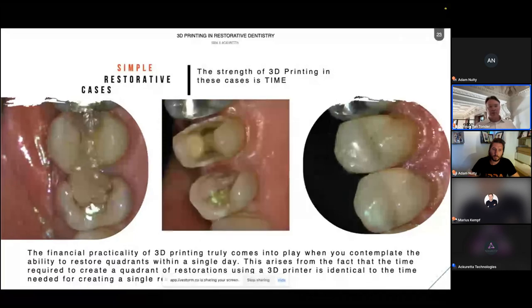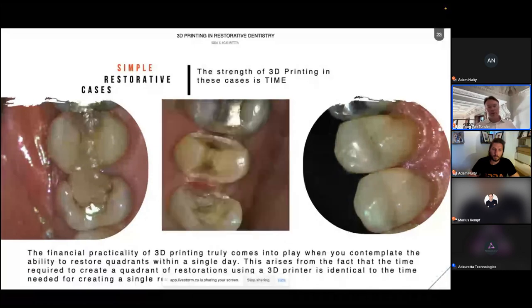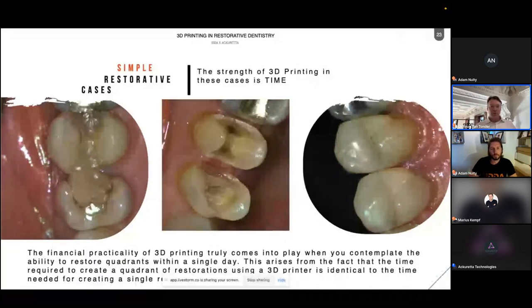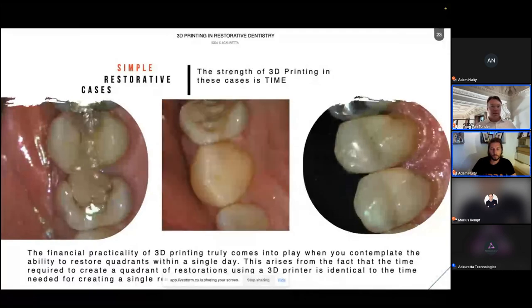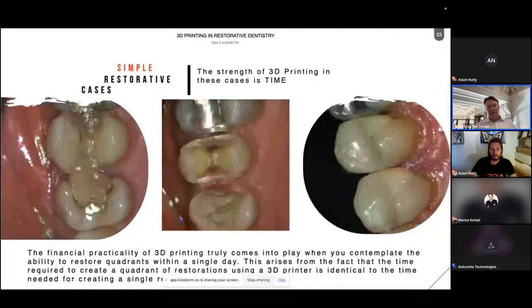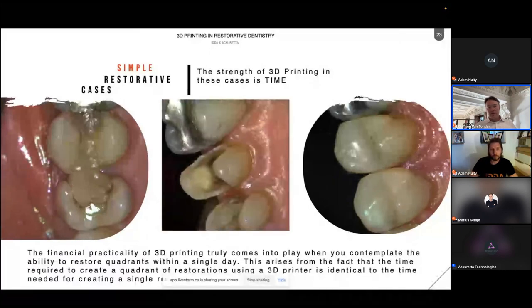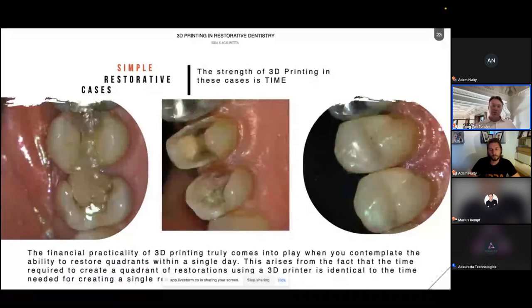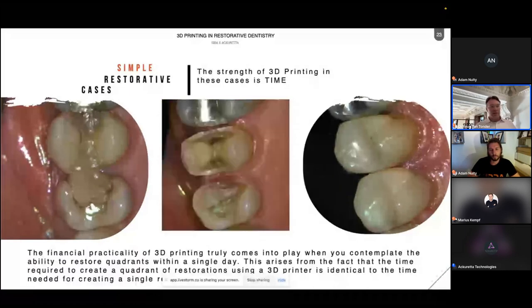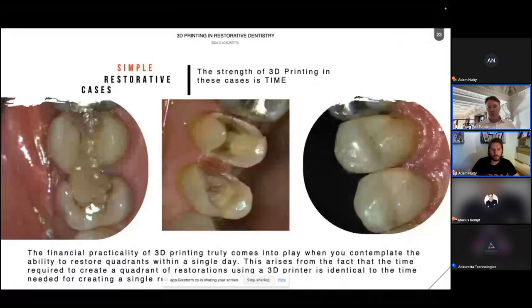You have to make sure that you are setting your parameters for your designs and everything correctly so that you have space for your cement to flow out and things like that. So it is a bit technical, but this is just one of the things that we can do now with 3D printing. I think one of the things I want to highlight is that your case selection has to be correct. Not every patient will be suitable.